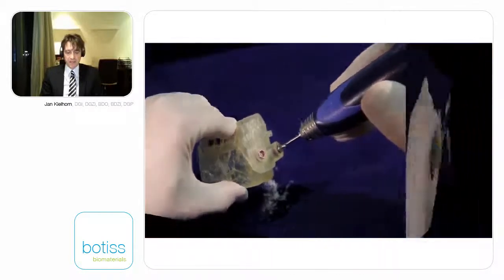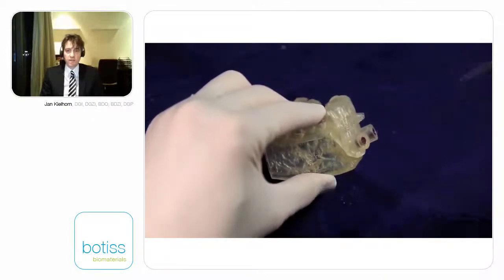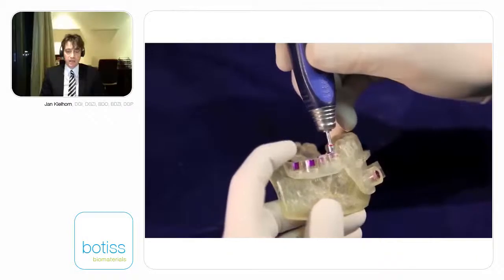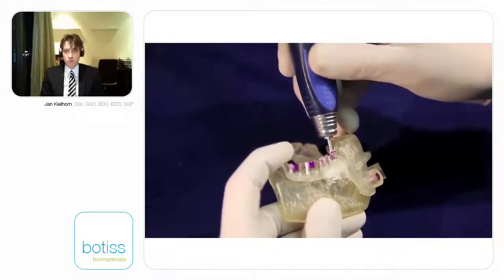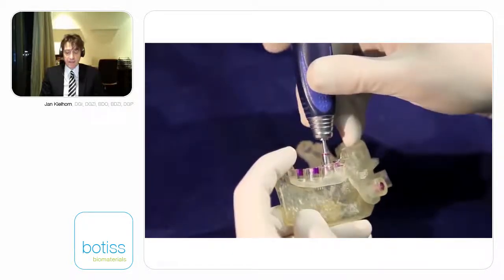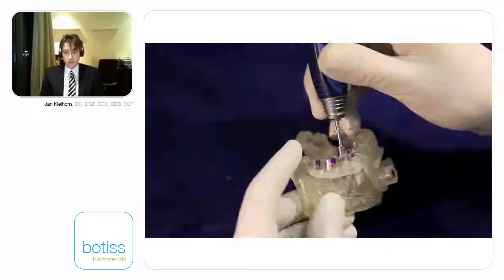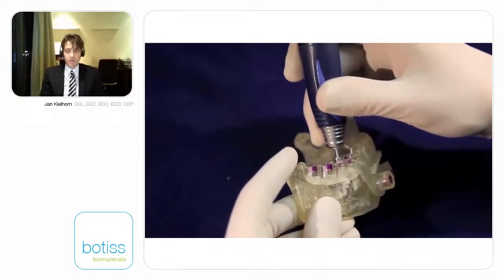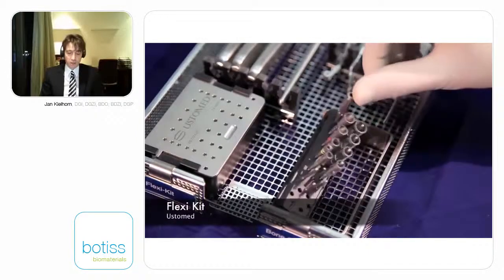If you see in the movie, you can take out the rings if it's autogenous bone from the chin area, from the linea obliqua externa or else. You can, with the 3D data, check where's the best spot to take out the bone ring. And you could also, of course, take allograft ring, which you can get from the botiss, which is an allograft ring already prepared in the size you would need, and use that also for augmentation.